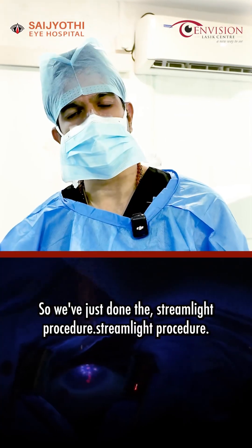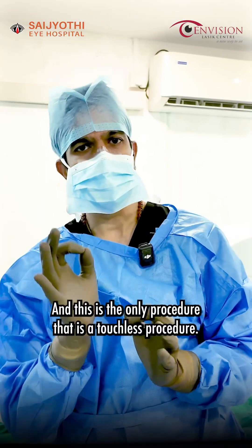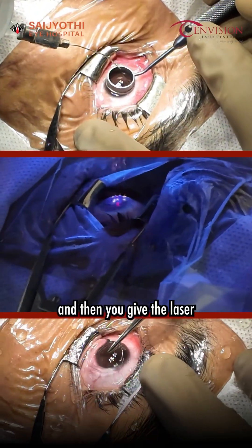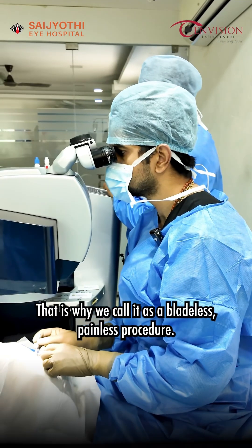We have just done the Streamlight procedure. It is a completely bladeless, touchless and painless procedure, and this is the only procedure that is a touchless procedure. We will peel the skin and give the laser. In this Streamlight procedure, the peeling of the skin is also done with the laser. That is why we call it a bladeless, painless and touchless procedure.